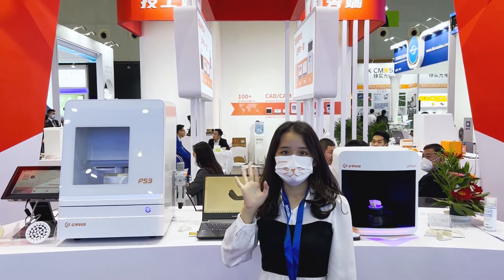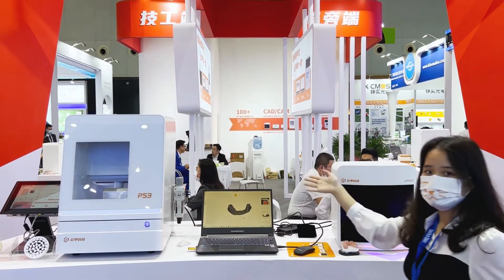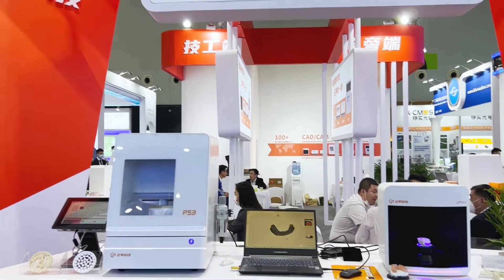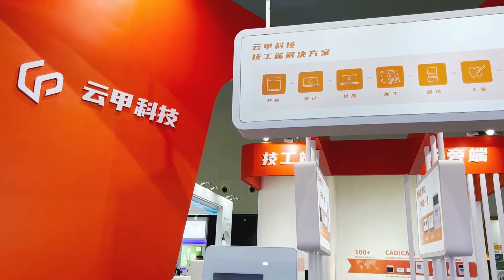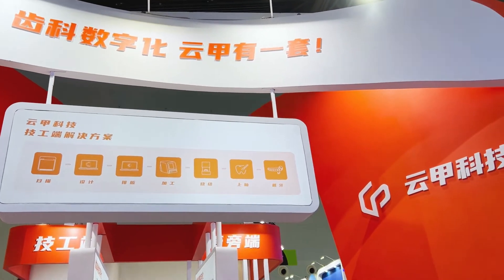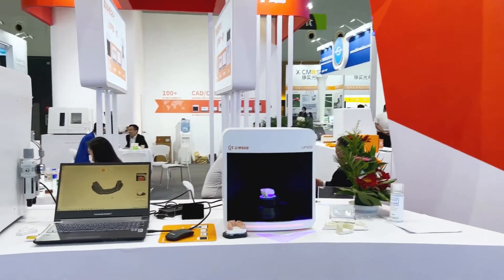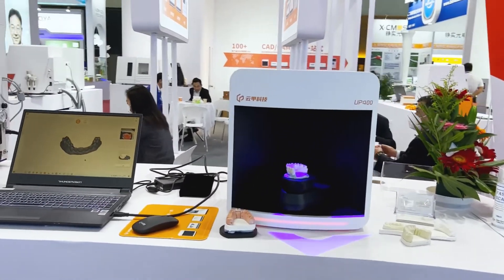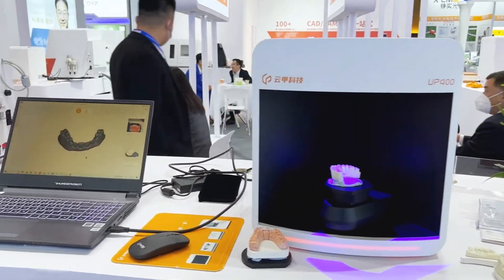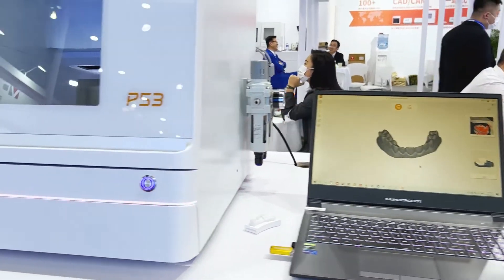Hi everyone, this is Lily from R3D. Now I will show you around R3D's books for lab tech products. We are one of the few companies in the world that has developed the full dental CAD/CAM solution with software such as dental scanners, dental design software, dental milling machines, dental nesting software and CNC software.